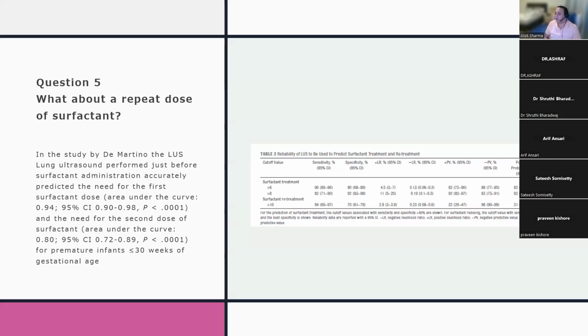And the question that I would always ask is, can I take this baby off the ventilator? If I'm keeping him on the ventilator, what am I doing to optimize his condition to actually get him off the ventilator? And I do that every day until we get the baby off the ventilator. But a repeat lung ultrasound if the baby's improved clinically is really not necessary. The reason I would do a lung ultrasound is if my baby's not improved, i.e., he still has work of breathing. Clinically, I'll go back, I'll examine him.